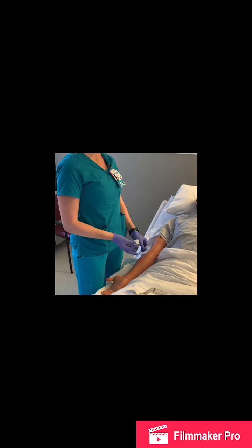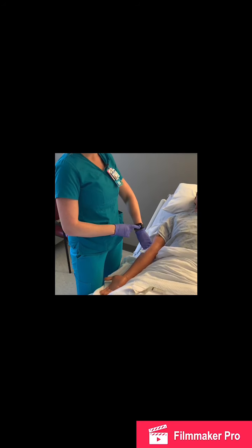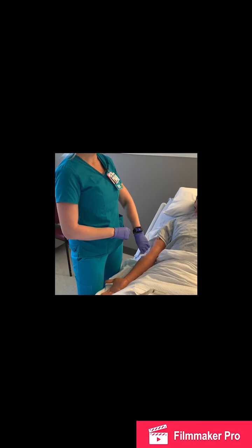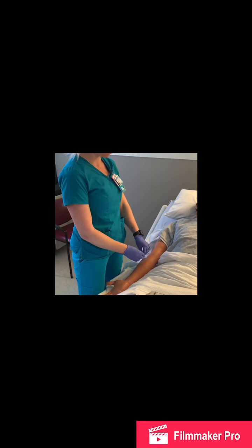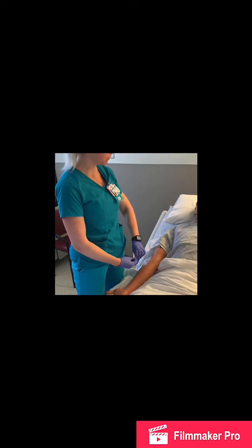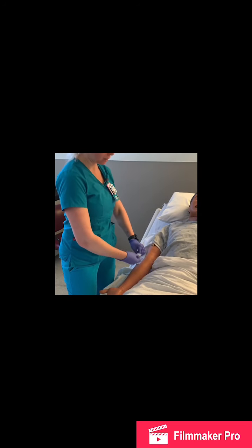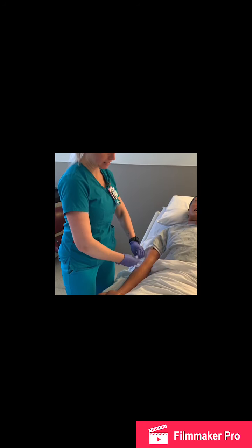We have to inject them over about 5 minutes, so I'm just going to make sure that I'm looking at my watch and timing for those 5 minutes. It is going to be a little bit of a slow process. So if you feel like you're experiencing any side effects from that, you just let me know. So I'm scrubbing my hub here for at least 10 seconds.